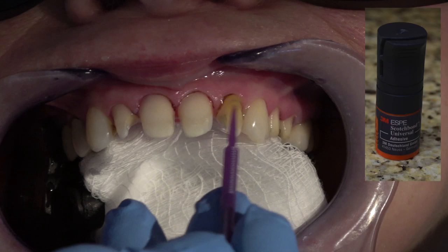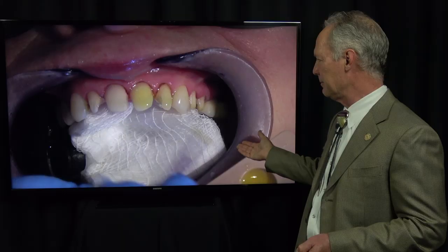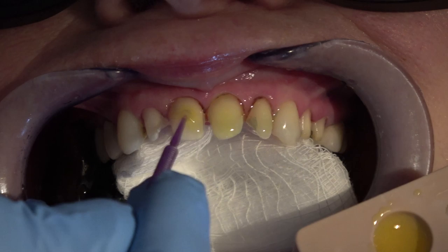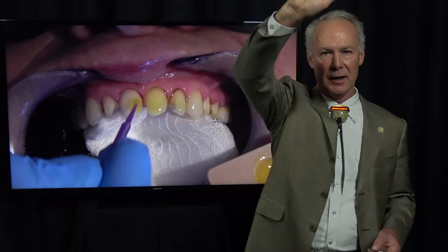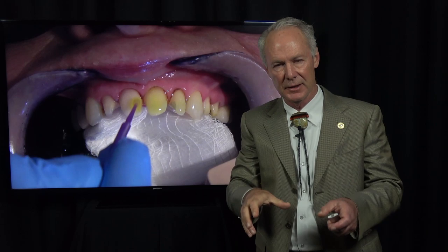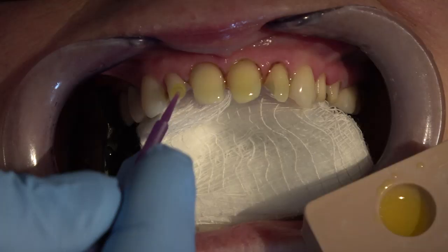Then we're placing primer adhesive. This is 3M on the teeth. I want the teeth to be just a little bit damp. Coat it on there. Now before we've done this, we've turned off the lights in the operatory. The only light that's available is the actual operatory light, which is turned down to the feet of the patient. So it's just a glow. It's not an intense light. Otherwise, it'll set this unfilled resin up.